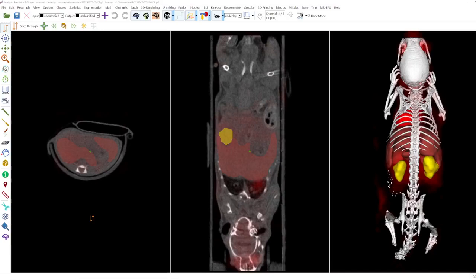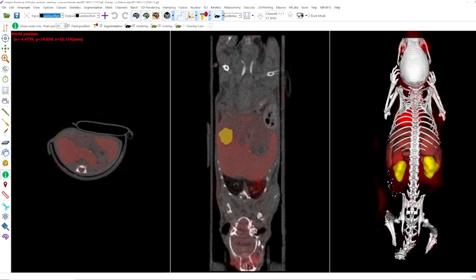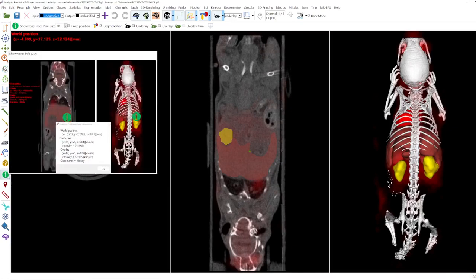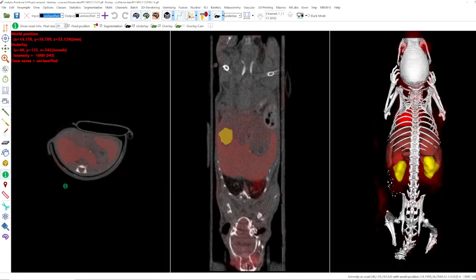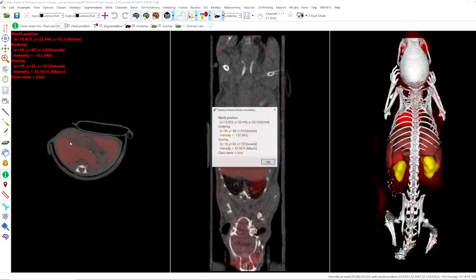Hello! In this short video I would like to explain the mouse action 'Show Voxel Information', which you can find here on the mouse toolbar on the left side. What it does is provide some information about the voxel where you hover with your mouse cursor — for example here in red — and when you click on the position, a box will also appear and you can screenshot this box to save the data.